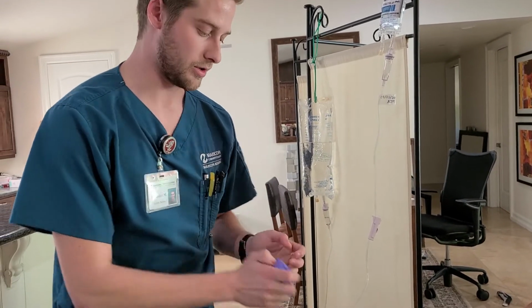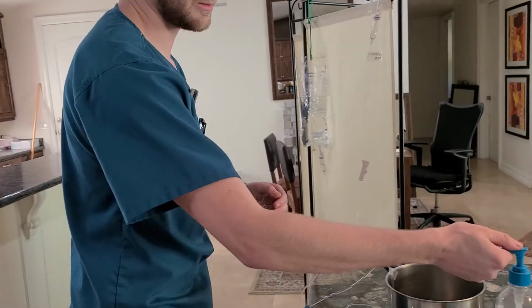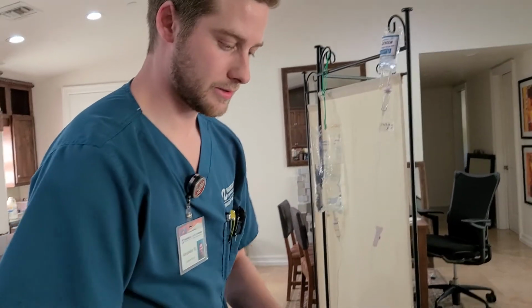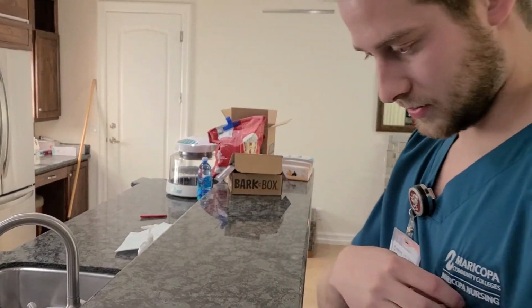No. All right, so I would grab this, I would throw these away per facility policy, and then I would wash my hands. And now I will go document. So I'm going to bring my MAR over here, and these would be thrown away. And now I'm going to document here.